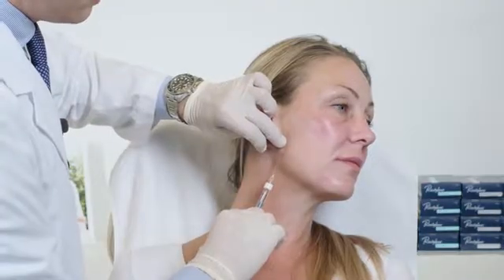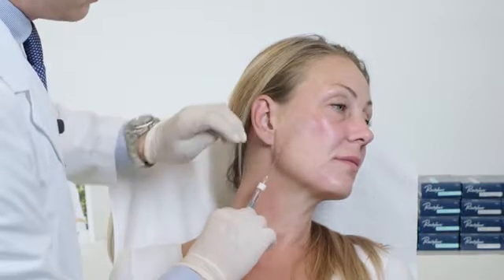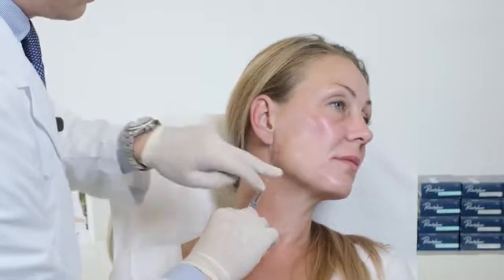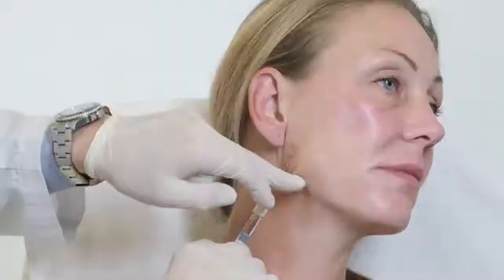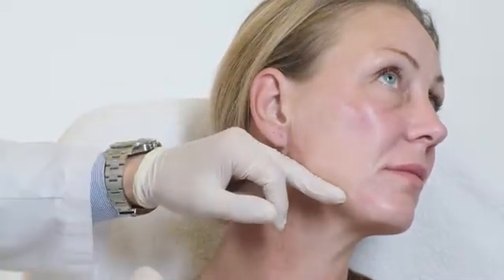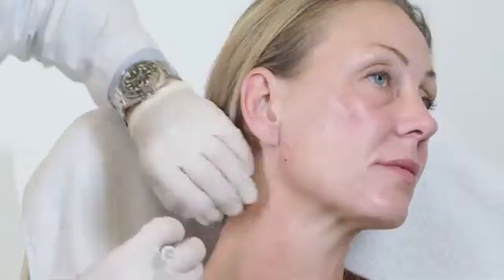This is a treatment indication and a treatment area that will require slightly larger volumes. So far I've injected half a cc of Restylane, and I will use the rest of that syringe to inject along the lower aspect of the mandible and pull back the tissue as far as possible. It's important to keep in mind not to inject too much onto the lateral aspect of the mandible, as this would widen her face and make it look more masculine.